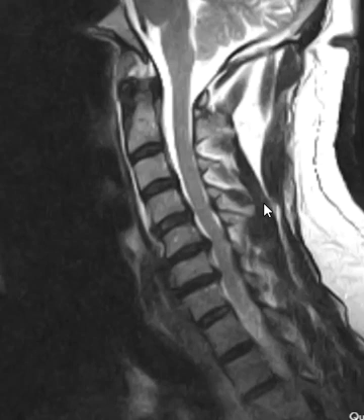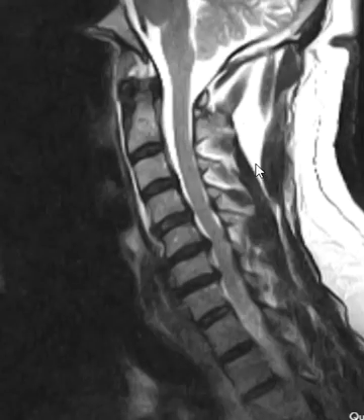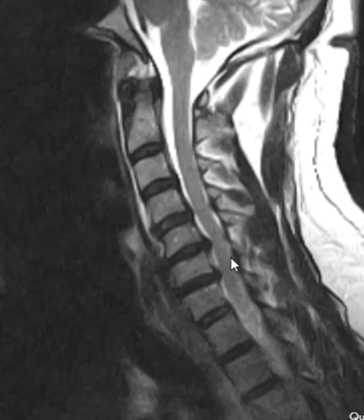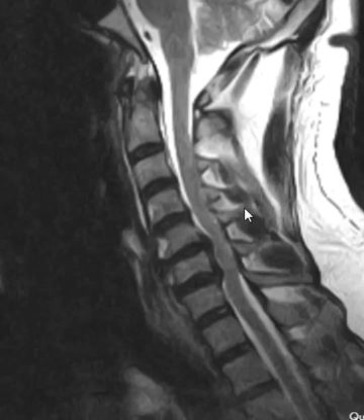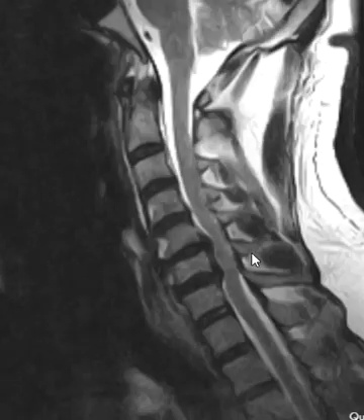And this is a really common finding, where we have symptoms that can be explained by either a pinched nerve in the neck or something intrinsic in the shoulder. And it's complicated because there are findings in the neck that would explain the shoulder pain and also findings in the shoulder. So if the patient had just had an MRI of the neck, we would have seen these disc herniations I'll show you in a minute, and we would have said, okay, we have the findings, we're all done, and we'd miss the abnormality in the shoulder.